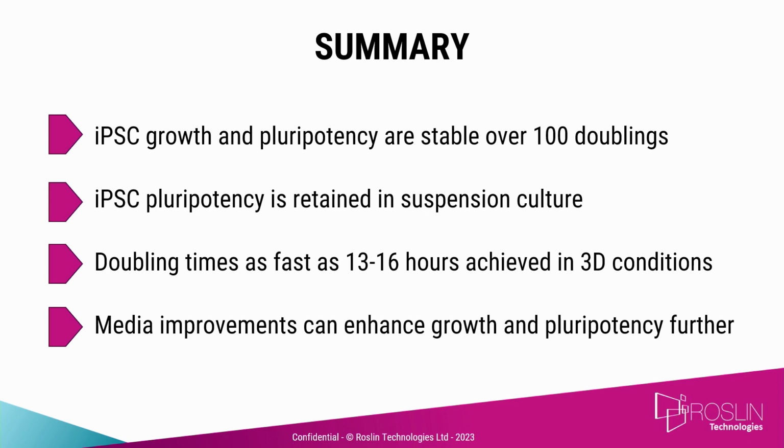The trick and the challenge then is how do we differentiate them in that environment? Pluripotent stem cells are more difficult to differentiate than primary cell lines. They're further back in the lineage. But we are making significant advances in that. You'll see from the posters that I referred to earlier how we've actually managed to direct the research to improve the timelines around that. And media improvement.